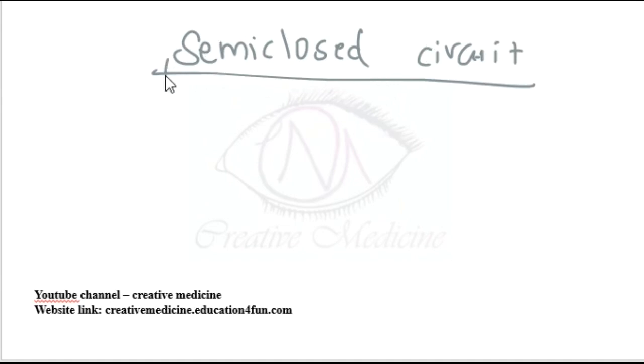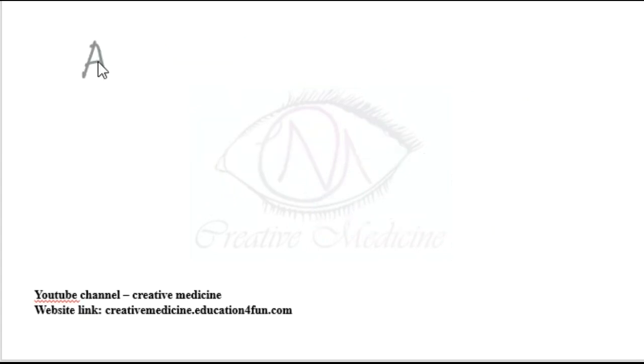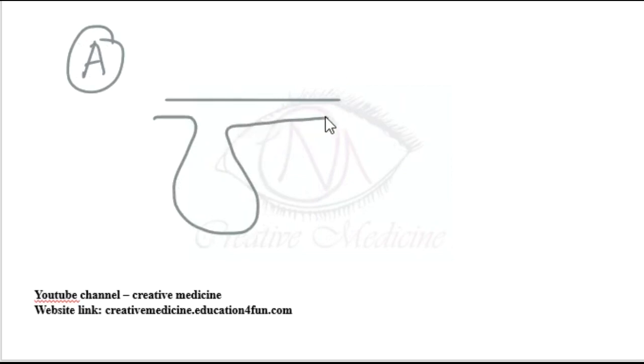Semi-closed circuits or Mapleson circuits. Mapleson circuits include A to F. Mapleson A. Here, the fresh gas flow... Here, Mapleson A circuit is also called as Magill circuit. Expiratory valve is present nearer to the patient in Mapleson A.